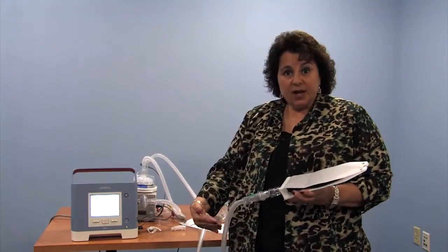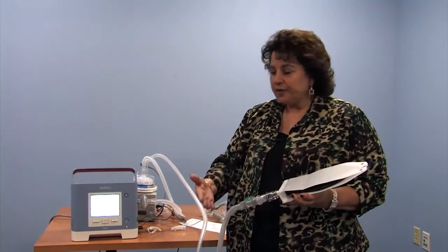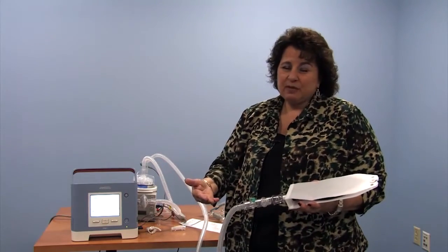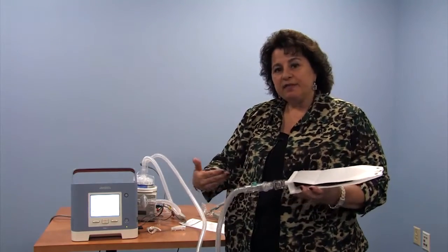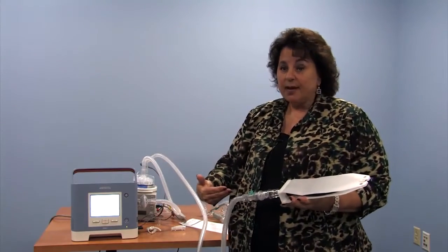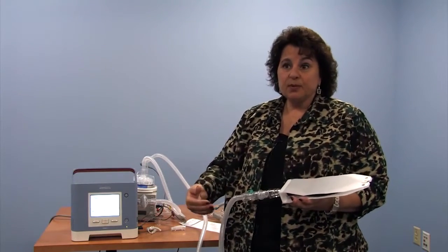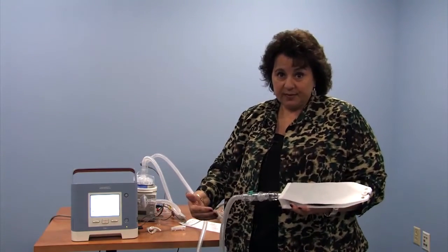What we find in these young, weakened children and infants is that because they're unable to trigger the device at times, we need to set our backup rate higher than you would think. For the adult population, maybe they would have a backup rate of 8, even the teenagers, those that you know can trigger the machine. But if we find that our patient cannot consistently turn the breath on or trigger the machine, given the setting that's on there, we will set a rate slightly below their sleeping respiratory rate so that they will be able to receive the benefit of the assisted breaths or the BiPAP breaths.